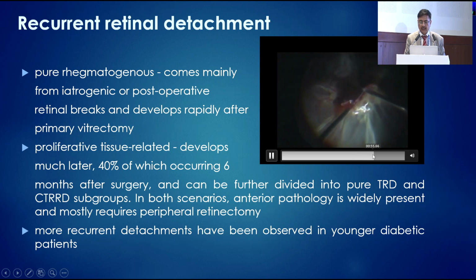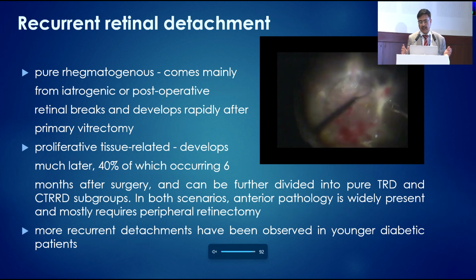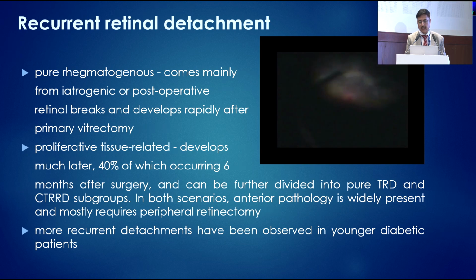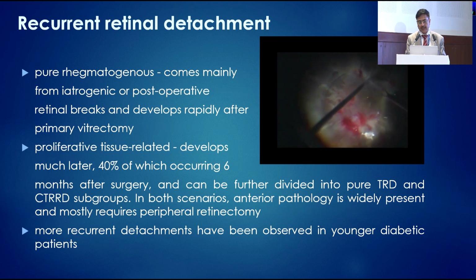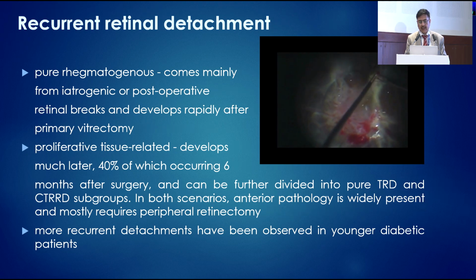Yeah. So last. So this is a tug-of-war technique that I use to tackle the recurrent detachments. Sometimes it becomes a crunch-like syndrome. So use 2 forceps and you pull them apart tangentially to tackle these membranes.